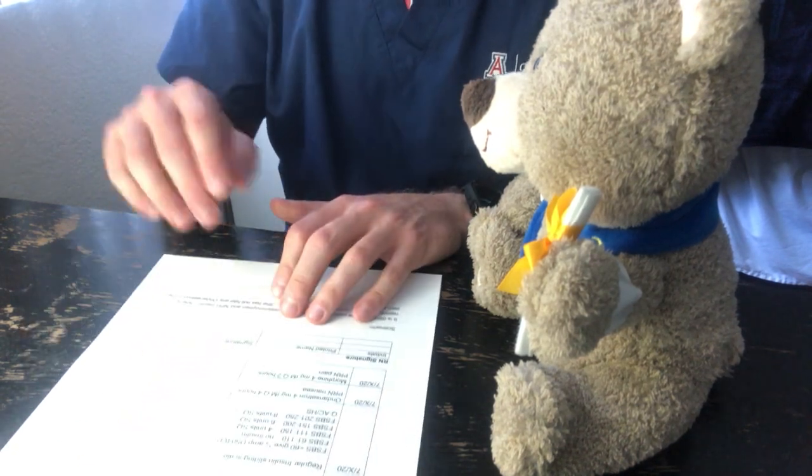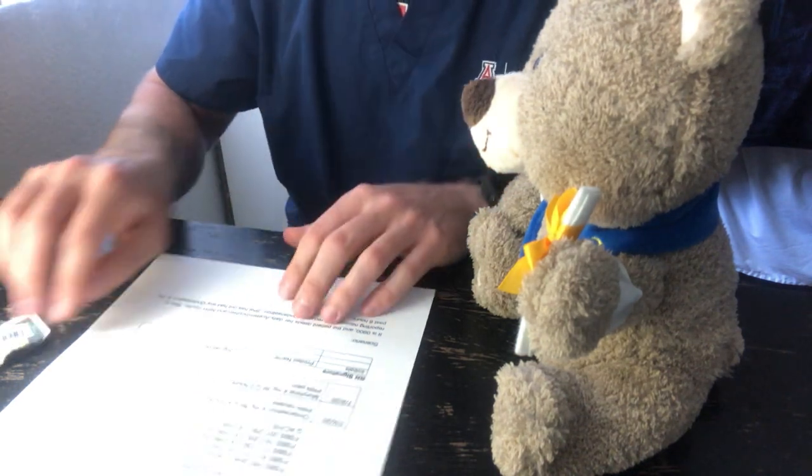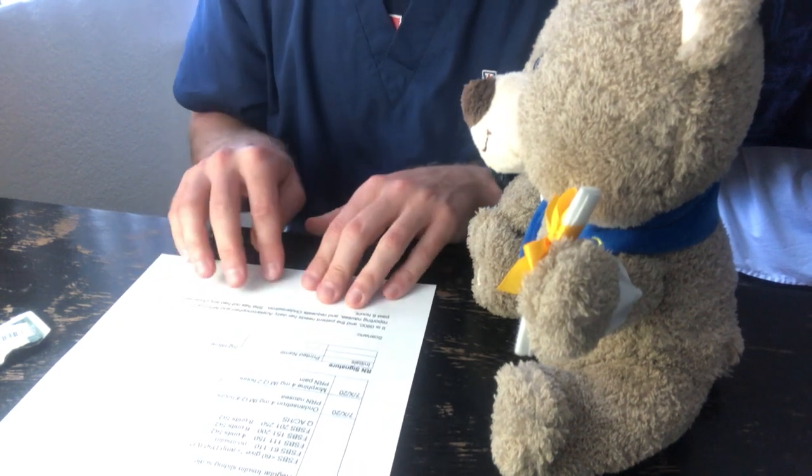She tells me a 7. So I'm in the MAR. I would first scan the acetaminophen, so beep. It pulls up, I click the appropriate box on the electronic MAR. I note the time, it's 9 a.m.